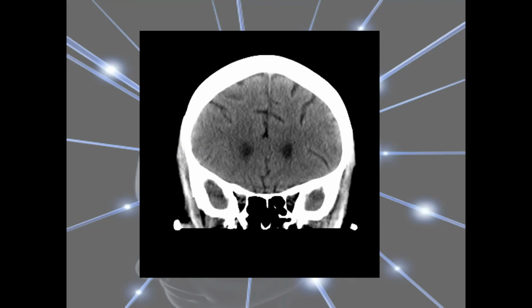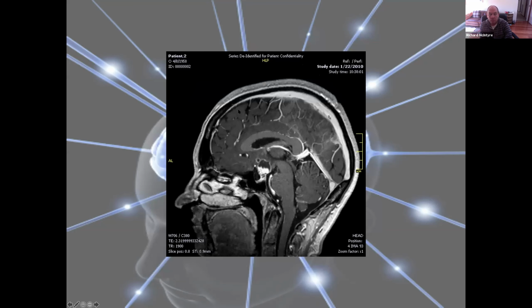Soft tissue. Perfect. Oh, well done. So it's soft tissue windows, okay? We see the bone there because it's absorbed radiation, but we don't see it very well. Whereas we see the brain parenchyma, the cerebrum very well. Okay, T1 or T2?